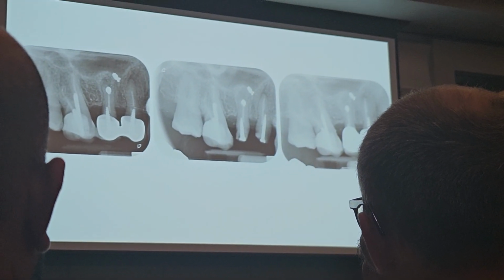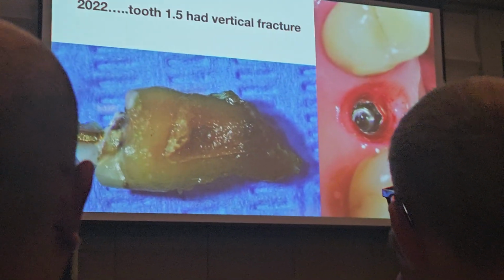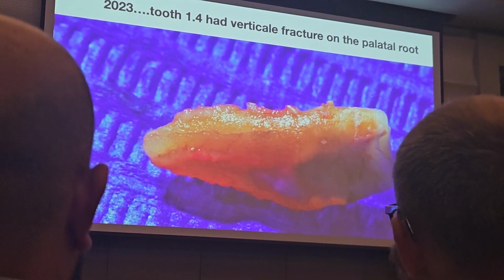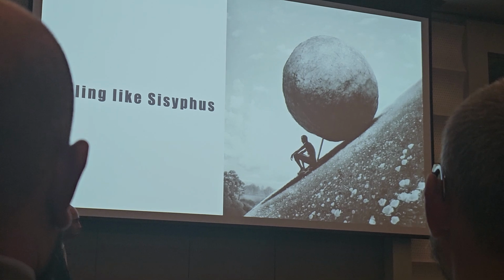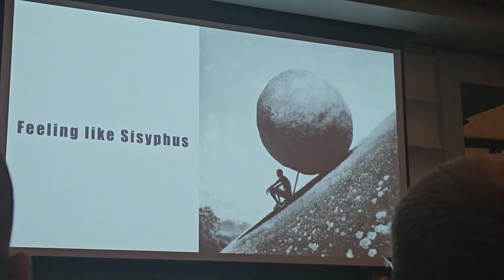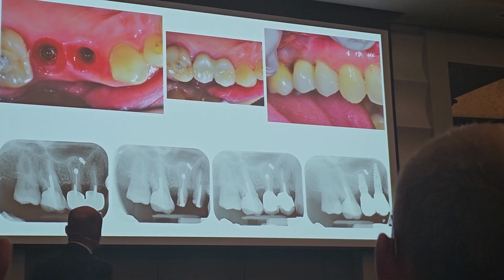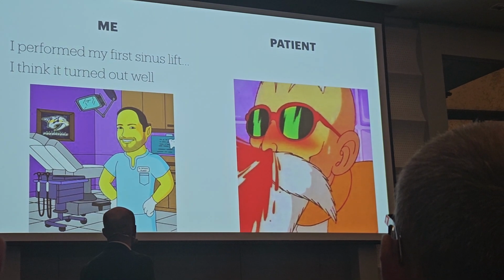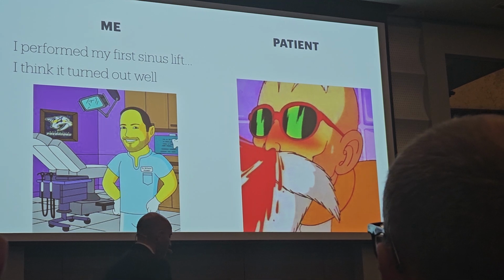Okay, this is the post-op follow-up. Anyway, the first failure. I placed an implant, and then again the other one. So sometimes we do like Sisyphus, okay? We do a lot of efforts and we get nothing. Then I placed 2 implants, I finished the case.